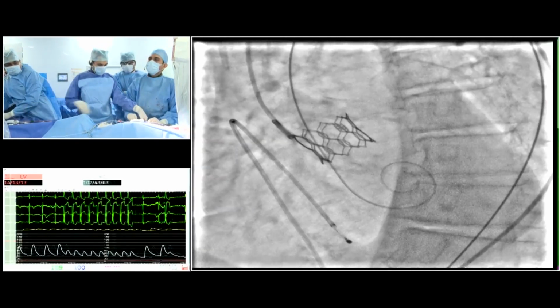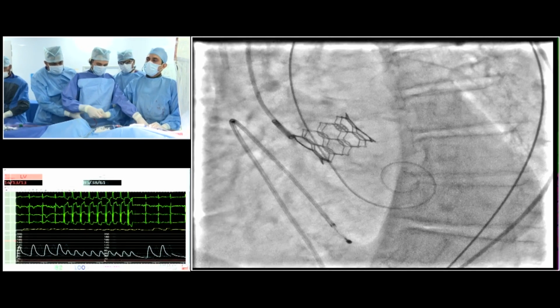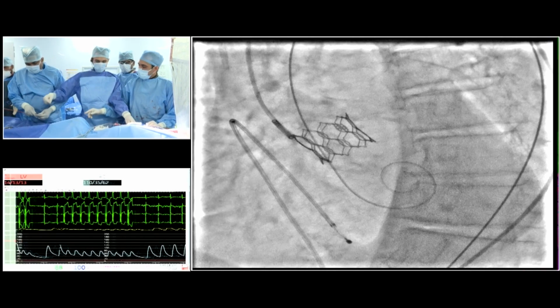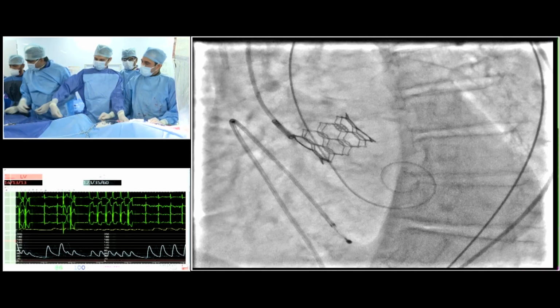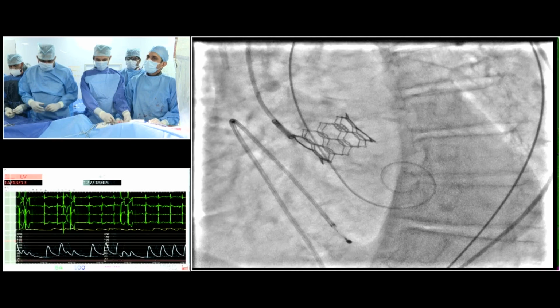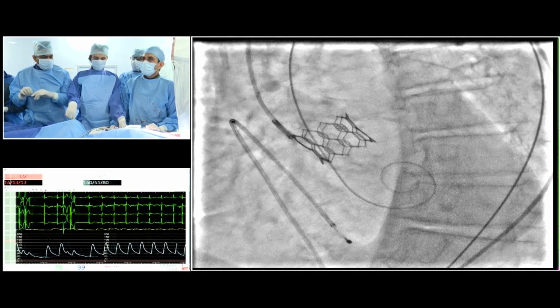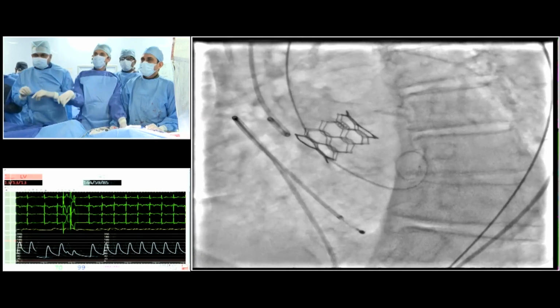But just look, you could see you have the upper cell, which is quite open. So the access to the main stem is quite easy. You can see the three posts. Let's put a pigtail. Three posts you could see on the metal. Yeah. It's quite far away from the main stem.